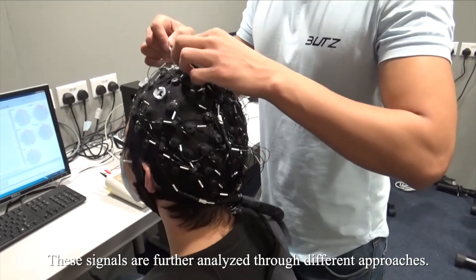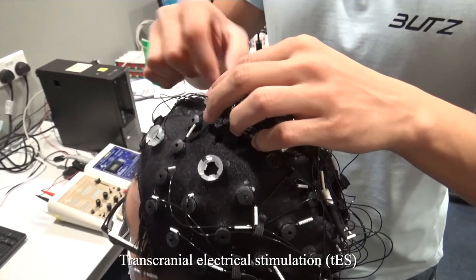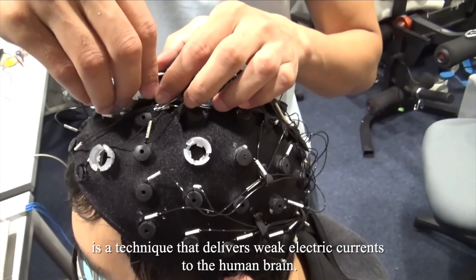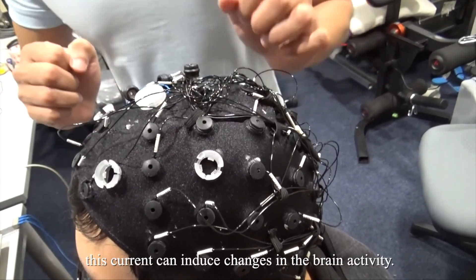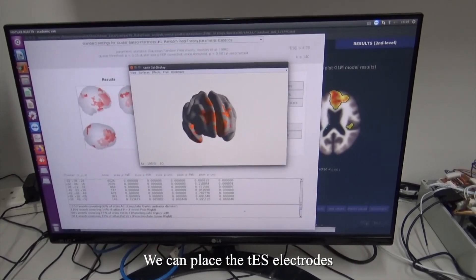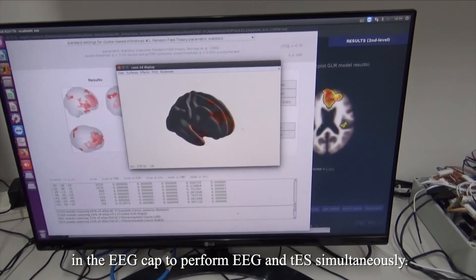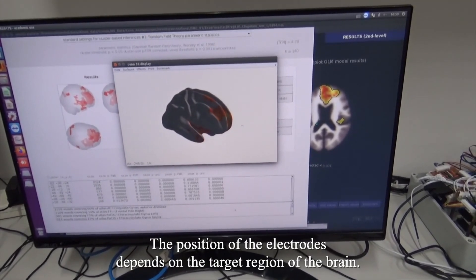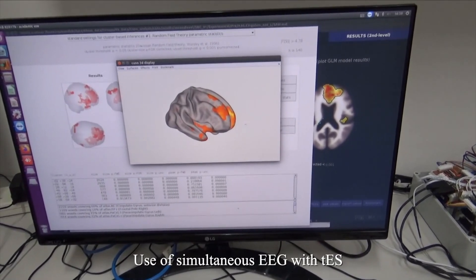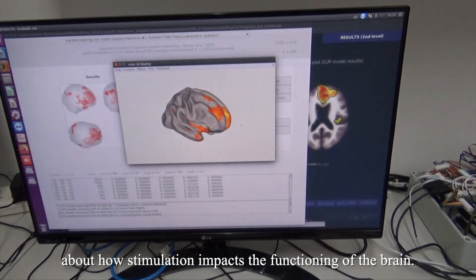These signals are further analyzed through different approaches. Transcranial electrical stimulation, TES, is a technique that delivers weak electric currents to the human brain. Studies have reported that this current can induce changes in brain activity. We can place the TES electrode in the EEG cap to perform EEG and TES simultaneously. The position of the electrodes depends on the target region of the brain. Use of simultaneous EEG with TES can provide valuable information about how stimulation impacts the functioning of the brain.